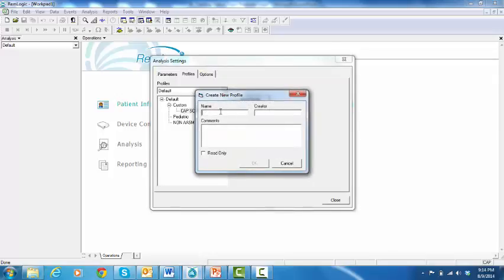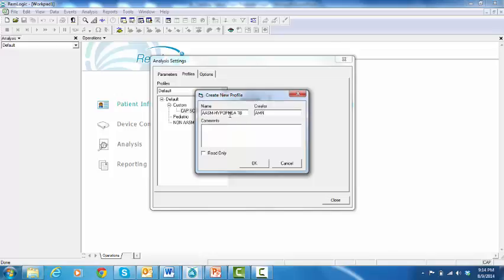for the profile. In the Creator text box, type your name, and in the Comments text box, enter comments or a descriptor for the profile.